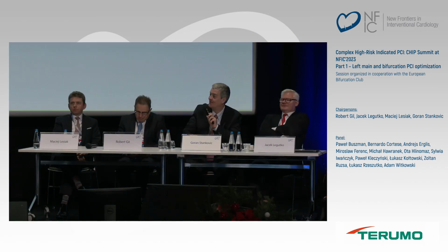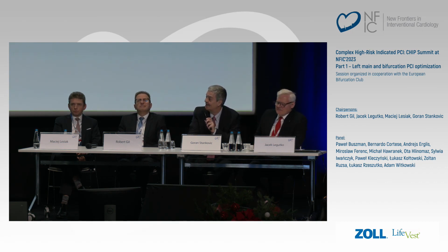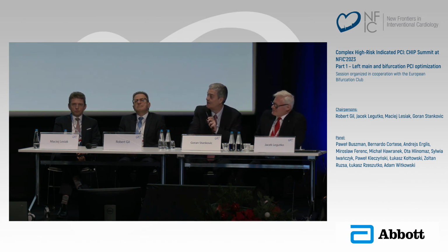Yeah, Andres, I have to answer. You said we disagree. We don't disagree. I just said this kind of angiographic improvement can be done with IVUS as well. Absolutely. So longer inflation time, from proximal to distal, does not apply only to angio guidance. So I say it's a friendly disagreement. Okay, Pavel, you wanted to comment?